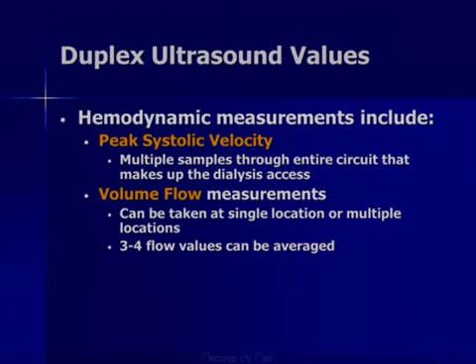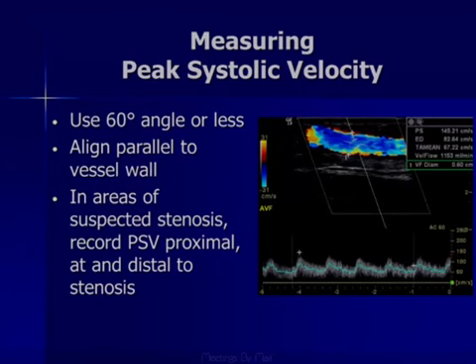For those of you who aren't in an IAC accredited lab, you may not know this, but starting next year, the IAC has added the requirement of taking a singular volume flow measurement somewhere, and we'll talk more about that in terms of where. But volume flow is done by many folks, and it was felt that it should be added.